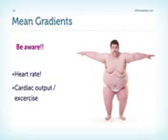But what is more important than absolute cutoff values is the fact that gradients are very strongly dependent on heart rate and, in particular, cardiac output. So if patients exercise, or if they're, for example, just anxious during the exam, this will raise their gradients.